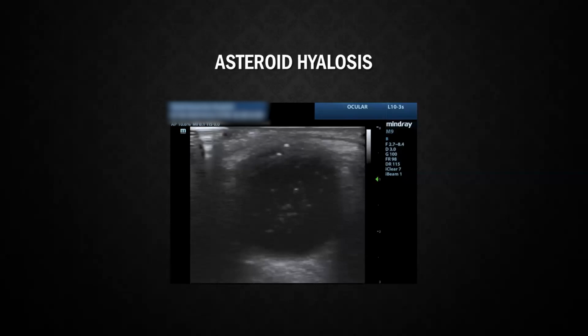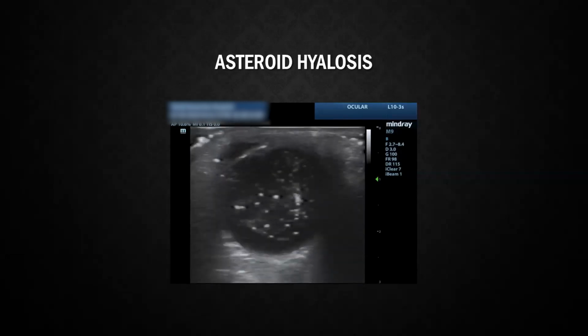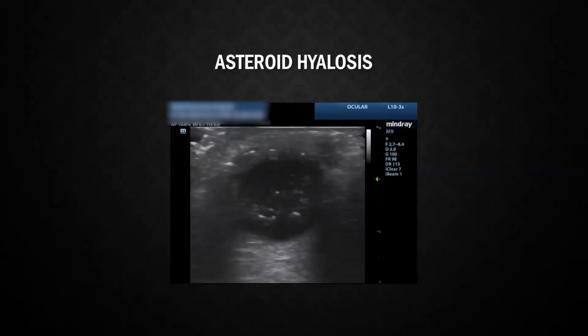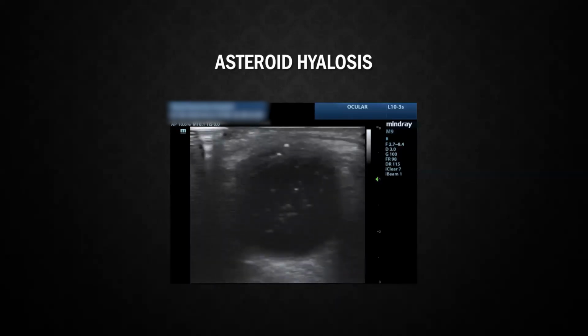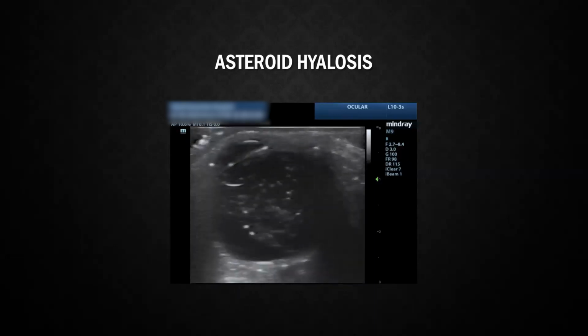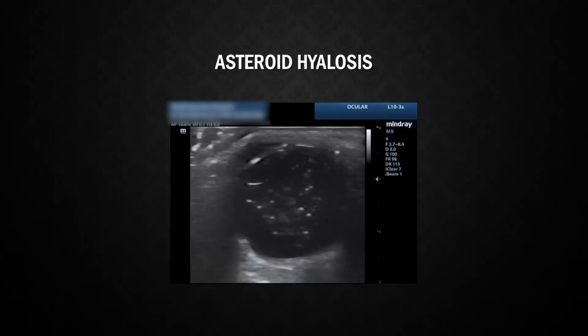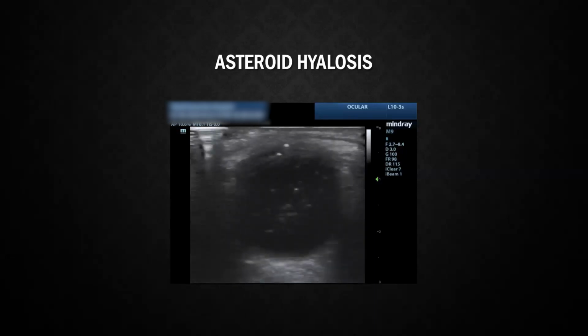I remember it like it was yesterday. Yeah, so this is probably an incidental finding. You might be comparing one side to the other. This is on the unaffected side, and you're like, what is that? And there's nothing to do for it. It's just something exciting that you found that you think about years later, apparently.